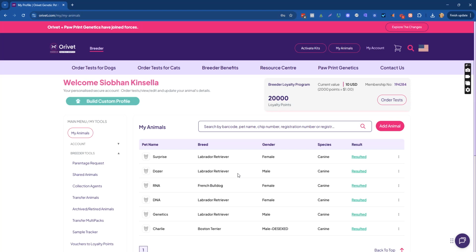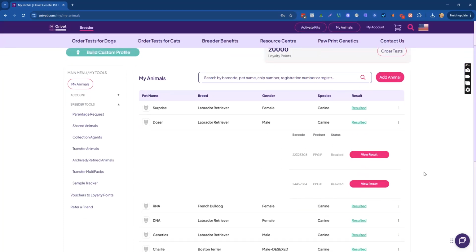In the genetic diseases tab, there are 3 columns: interpretation, test name, and result. The first column tells us the interpretation of the result, whether it was normal, whether they were a carrier, whether they were at risk, etc. The second column tells us the actual test that was conducted. The third column is the code for the actual result. Here we can only view. This is simply for viewing online on screen.